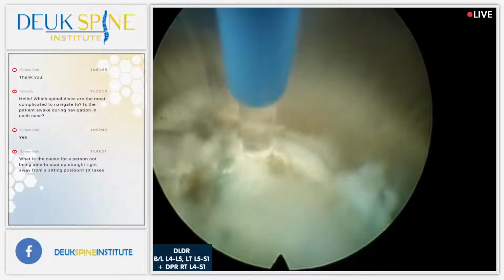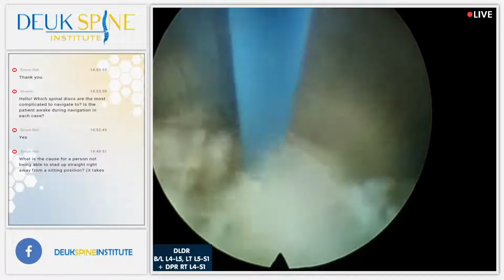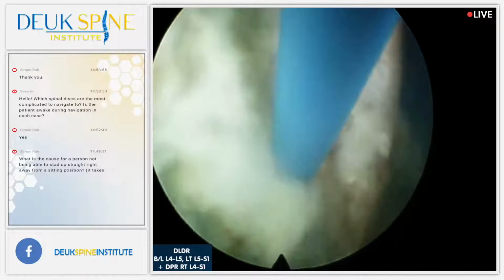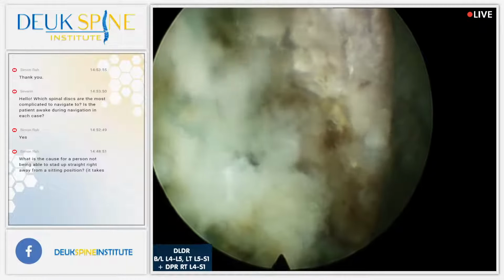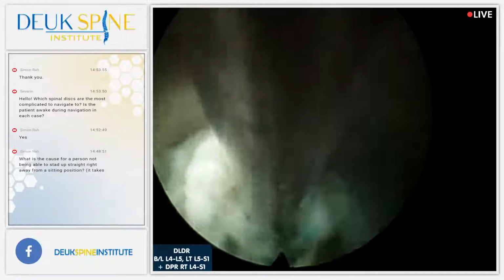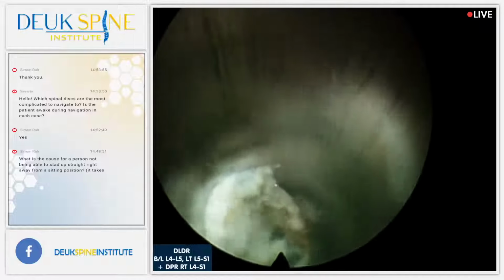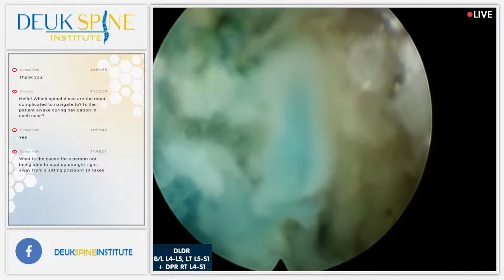We have another question. Sure. This comes from Severin on YouTube. Hello, Severin. Welcome. They asked, which spinal discs are the most complicated to navigate to? Is the patient awake during the navigation in each case? Severin, great question. So which are the most difficult spinal discs to navigate to? The answer is always going to be cervical and thoracic. But if you're talking about lumbar, the most difficult is L5-S1, followed by L1-2 and L2-3.